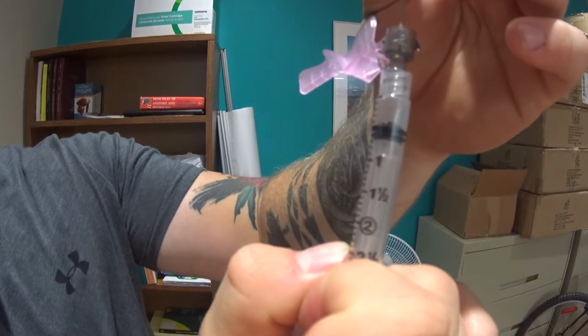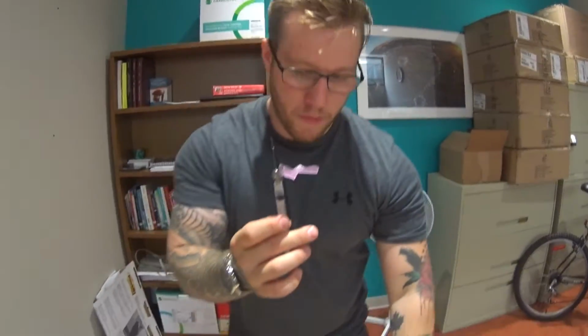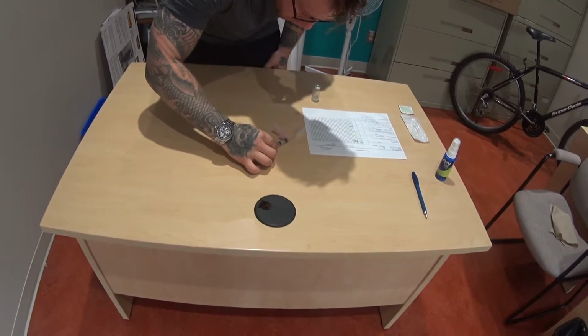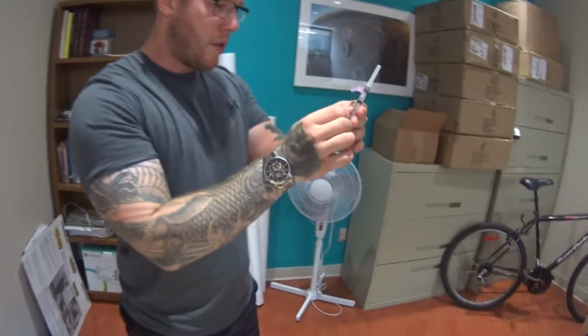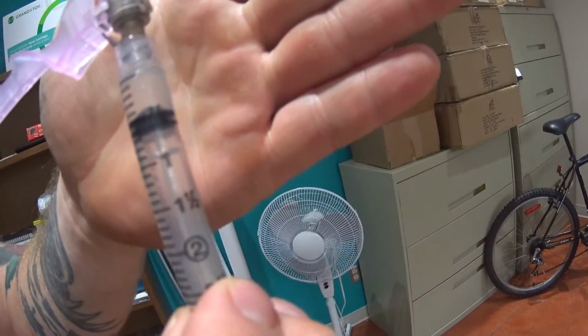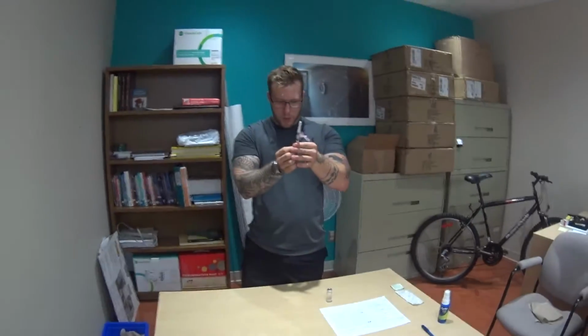So there we are. I'll take that out, and I'm going to scoop up the needle tip. There we go. If you want to get a better view of this, as you can see, I have 0.5. If that's easier, 0.5. Awesome. Great. So the air bubbles are pretty much gone out of this as well.